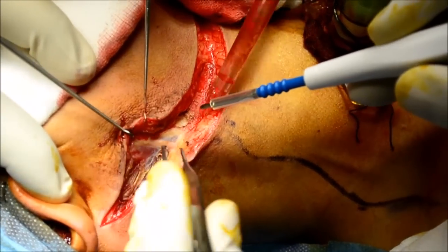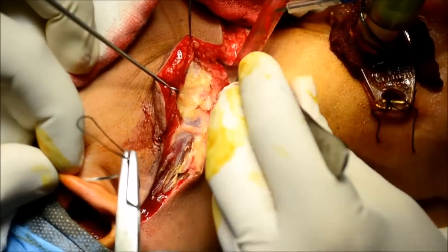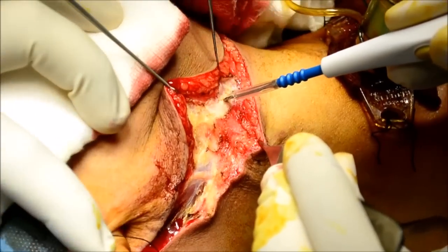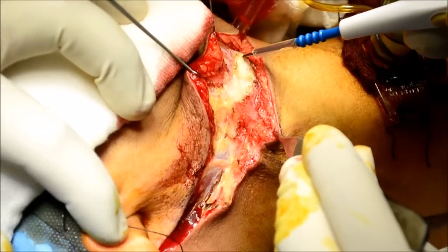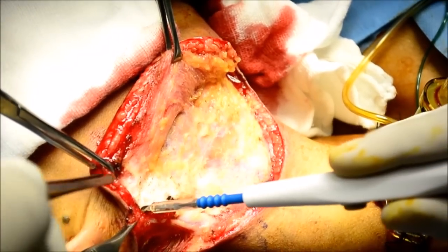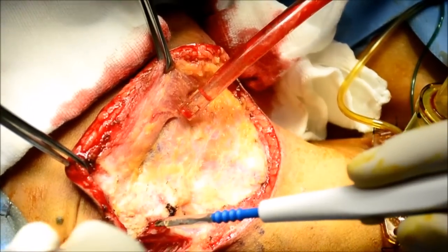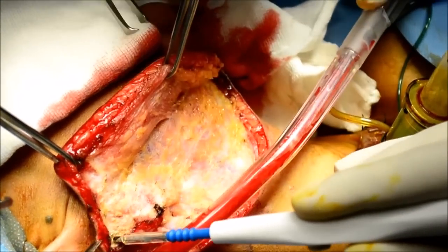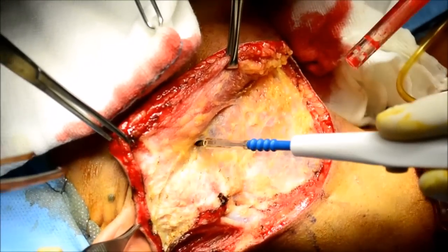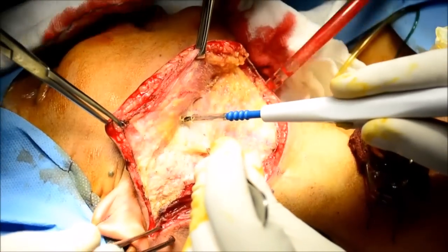The superior flap is elevated with cautery and the plane is subplatysmal. A couple of skin hooks are inserted and gentle traction and counter-traction is given so that you are in the right plane. When lifting the flap, be very vigilant about the marginal mandibular nerve.